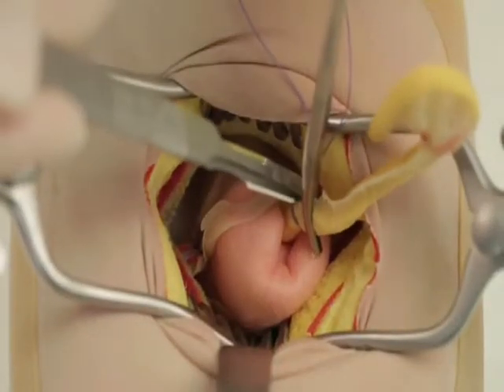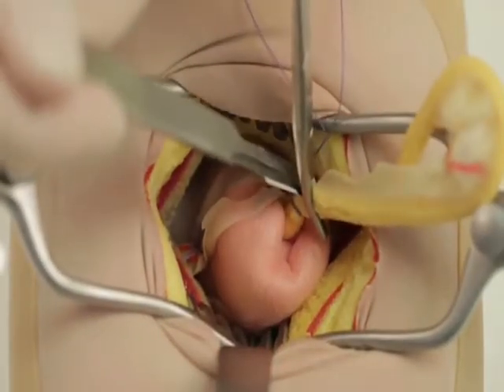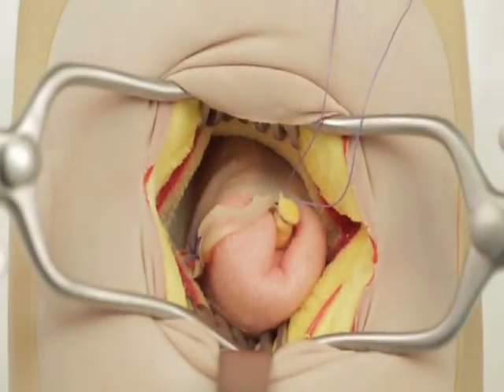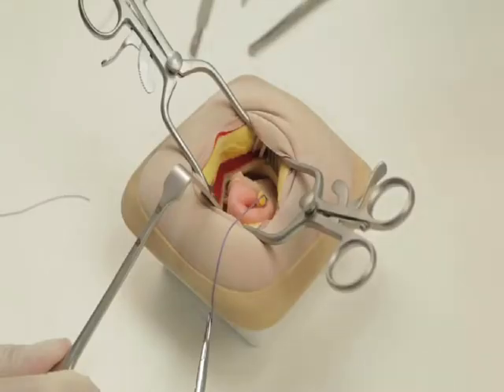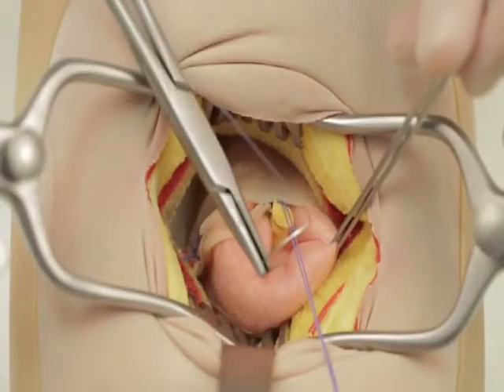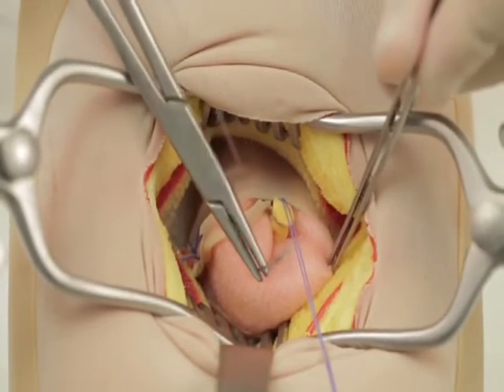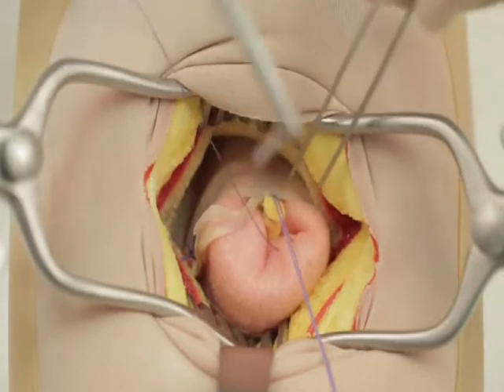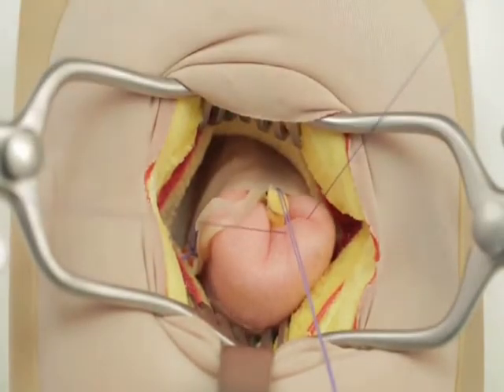Divide the appendix just proximal to the haemostat and place these instruments in a dish for contaminated articles. Insert a seromuscular purse string suture with 2-0 PDS or similar material on a round-bodied needle encircling the appendix base.